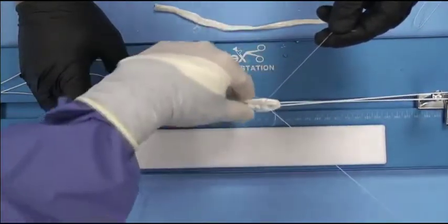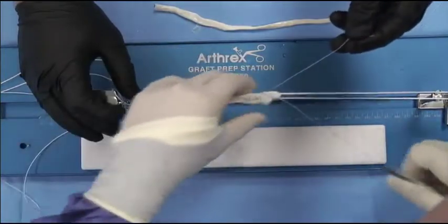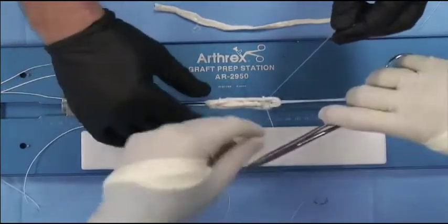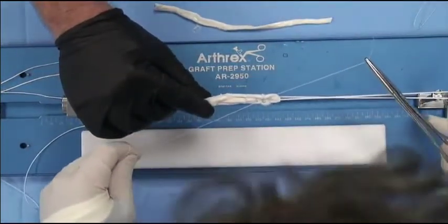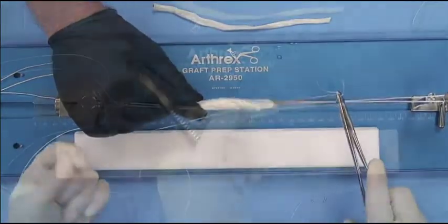and by doing so, you can see I'm creating a buried knot technique. So this is number 0 FiberWire with a buried knot, and it's very small at the end of the day, so you don't have it become bulky when you place it in your socket.